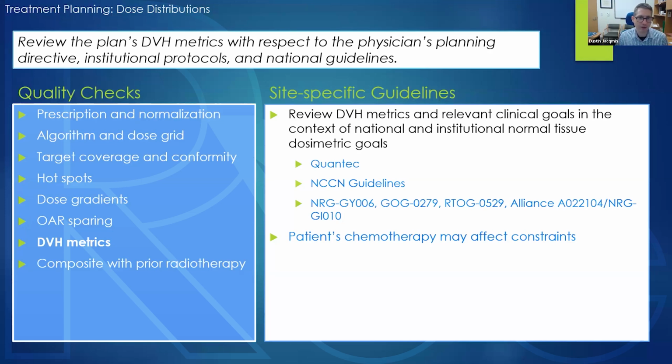Very often, the prescriptions physicians use are driven by clinical trials, and those clinical trials have objectives. So often the first place we go is those trials. And the second place we go is to the physician and say, hey, this doesn't match up. Radiobiologically, things aren't going to be exactly the same. What do you want to do? And we get some direction from the physicians we work with regarding how to apply objectives when the dose fractionation is a little bit different than the intended use.